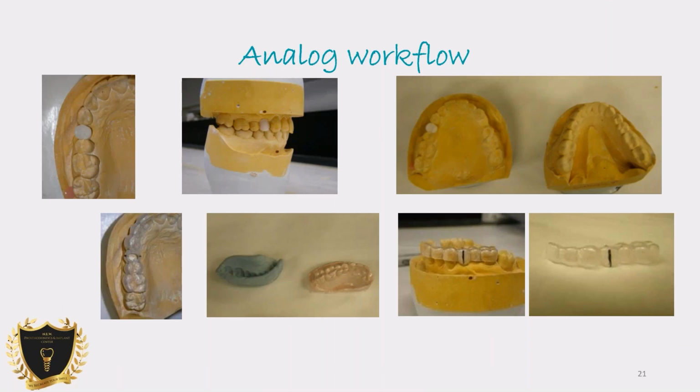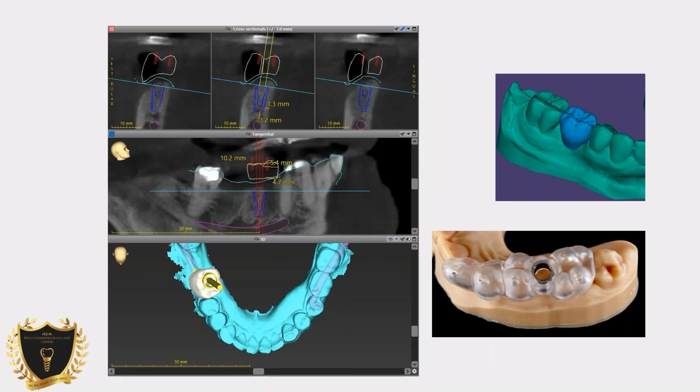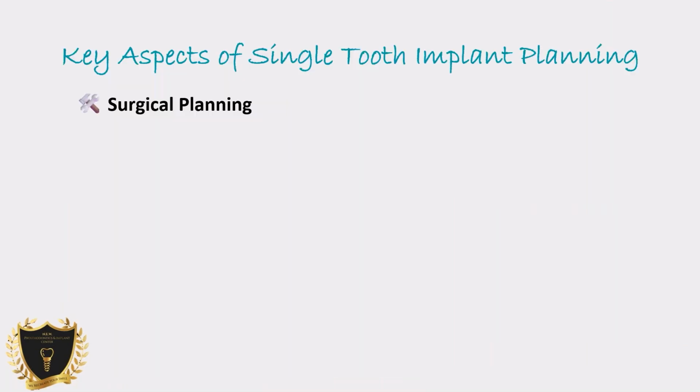This is what I was teaching students 15, 20 years ago, how to precisely place an implant in the dead center, so we can avoid any injury to the roots and get optimal results. In today's day and age, we can do a digital wax up. We can do it either on sophisticated software like 3Shape or ExoCAD, or a native scanning software. If you're using any scanners, they come with some kind of software, and you can put the tooth in there, or you can digitally design it on a computer and see it.